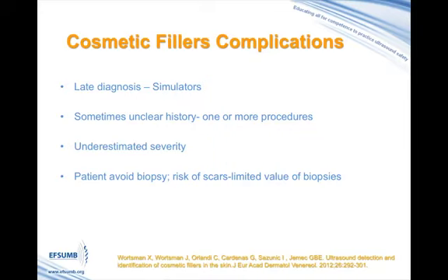First, their diagnosis can be late, and these complications can mimic other dermatologic pathologies. Sometimes there is an unclear history of injections of fillers. Sometimes the patients present several cosmetic procedures, and there is an underestimated severity of the complications. At the same time, the patients tend to avoid biopsies because they don't want to have scars.